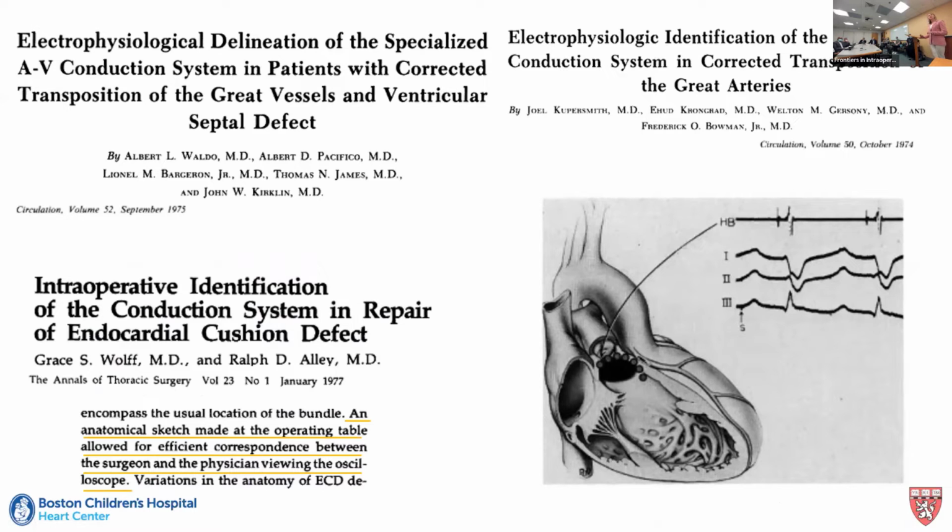There were a number of further studies at that time, smaller experiences from different areas in the country that looked at specific defects and tried to use this technique not just to avoid the conduction tissue at the time of that repair, but also to further our understanding of where the conduction system is likely to be in these lesions, adding to the body of knowledge that was already being generated from anatomic studies.